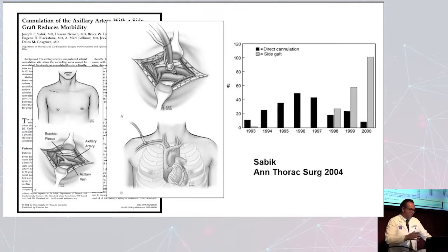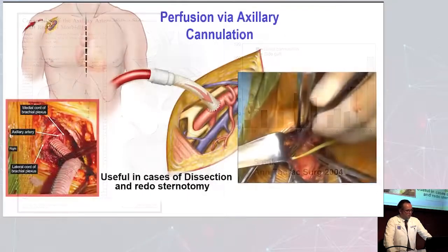We can flow, but we want to accommodate the perfusion needs, and that usually depends on the BSA. We choose a 10 millimeter graft or 8 millimeters. So I think at the end, as long as you can have a decent cardiac index to flow, it's fine regardless of the pressures that you get in the A-lines.